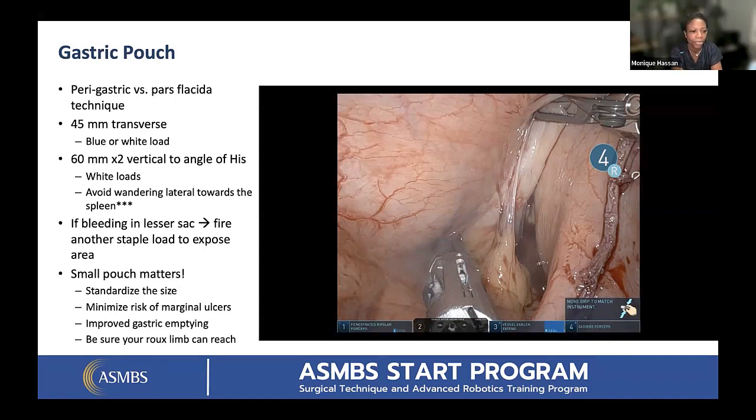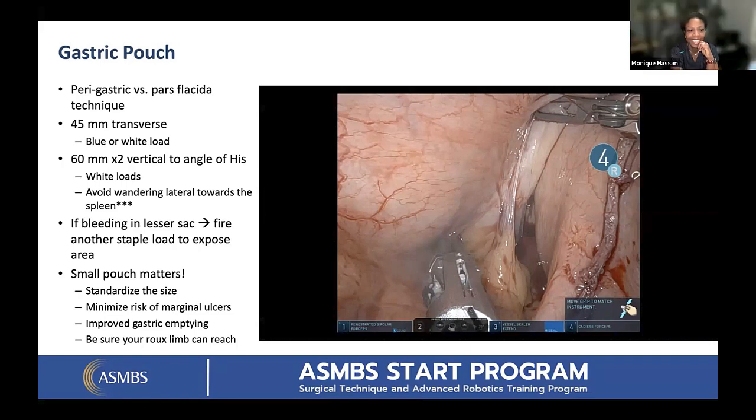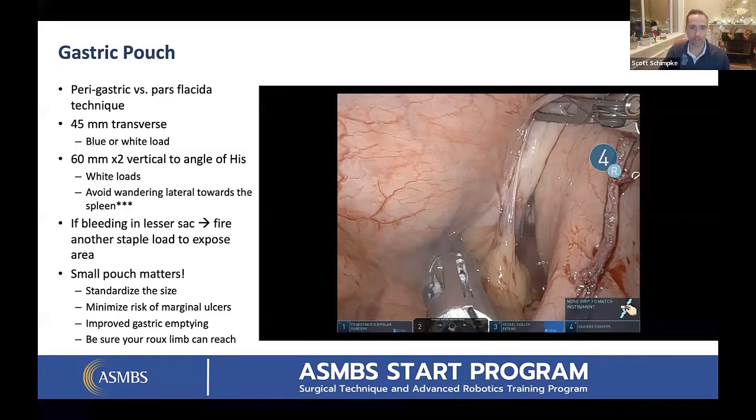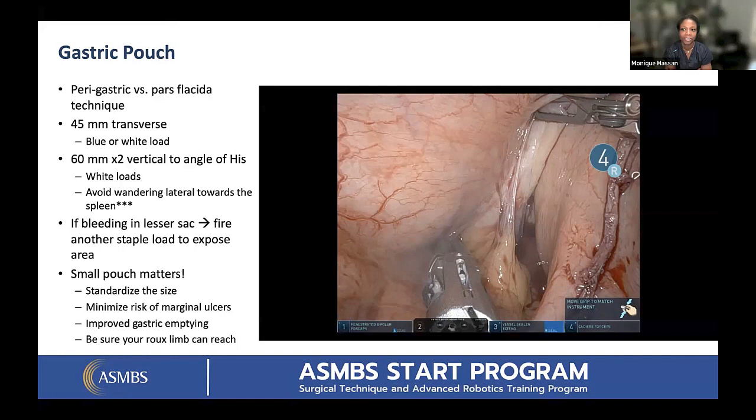Yeah, I agree. And I think oftentimes we're doing these bypasses in more complex patients and reoperative patients, and you have to do maybe extensive adhesiolysis, taking down all those things. Adhesiolysis, I can't even talk. There we go. Too much talking today. But you can do all that, obviously, robotically, and then you can get to the bypass. I've had to do a couple of times lysis of adhesions for an hour or two before you even start the bypass. Yeah, and it allows me to do that robotically rather than opening or just aborting completely. So, yeah, that was me today. And I was like, oh my gosh, laparoscopically, I was 4 hours, 2 hours of lysis of adhesions.